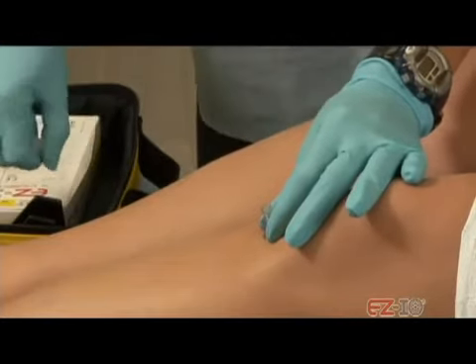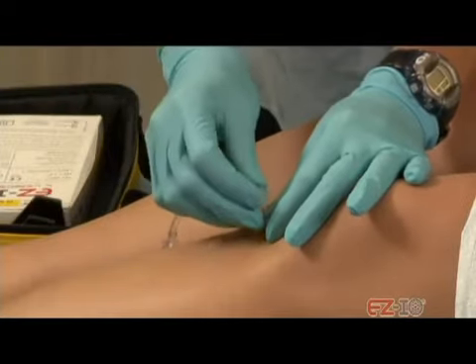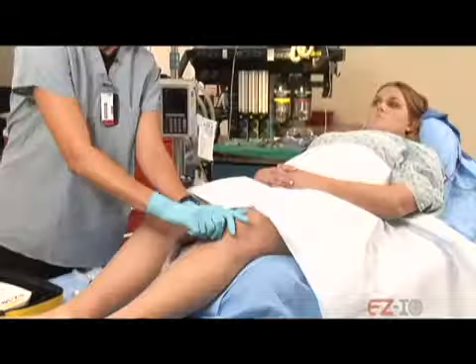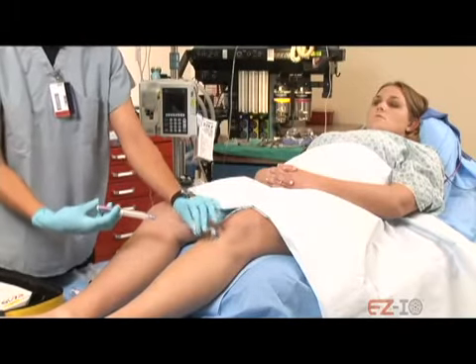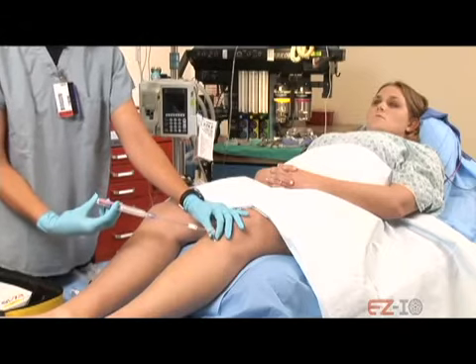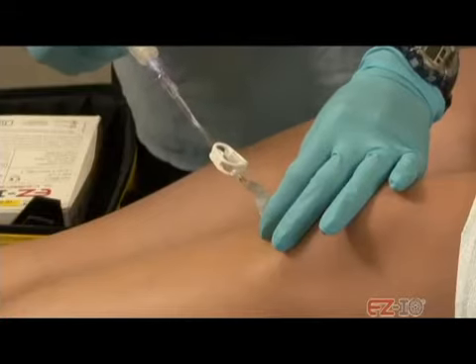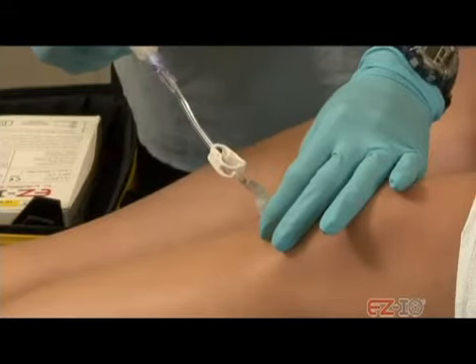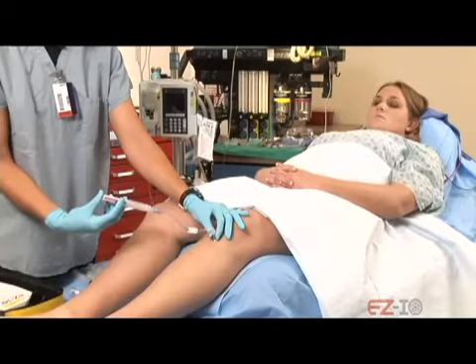This is the medication. It's going to make it numb, okay? So it's going to make it numb in there. As I'm putting it in, if I'm going too fast, if there's too much pain, let me know and I'll just slow down, okay? Here we go. Let me know if I'm going too fast. How are you doing? Fine. On a scale of 1 to 10, what's your pain? Like a 2. Okay. And now? Maybe like a 3. Okay.